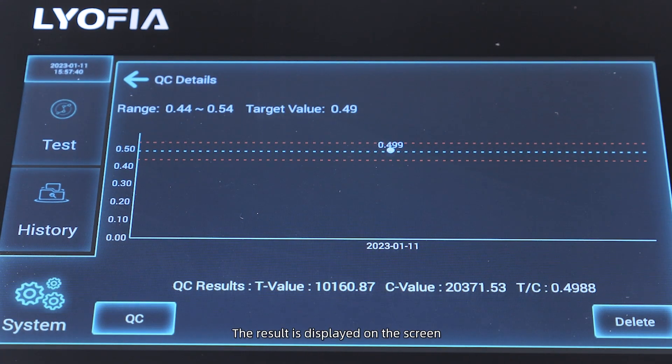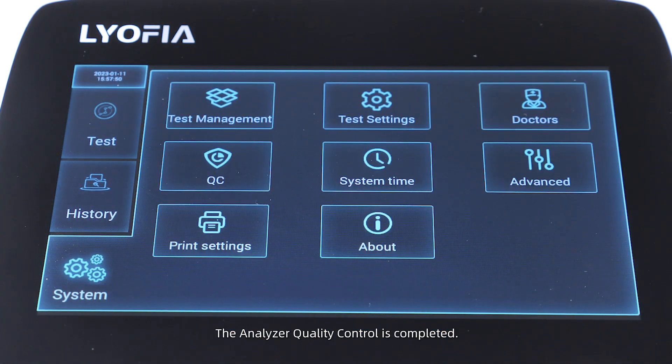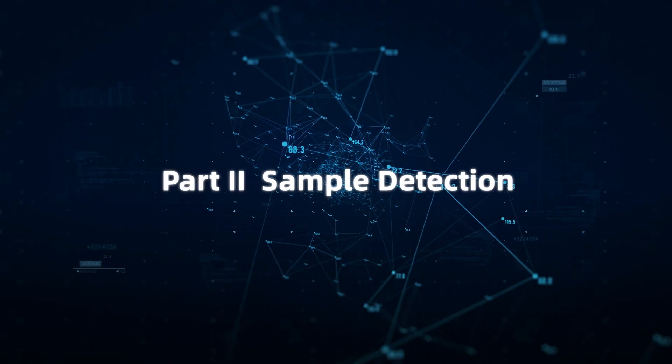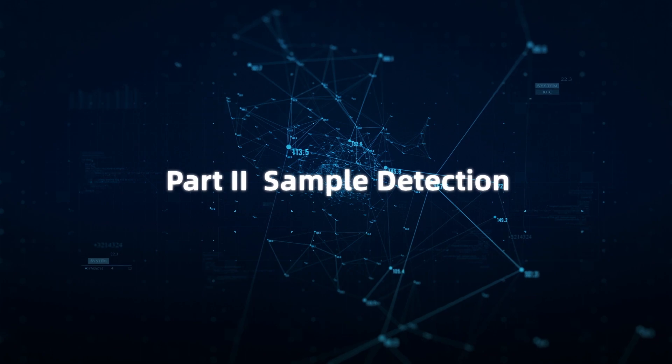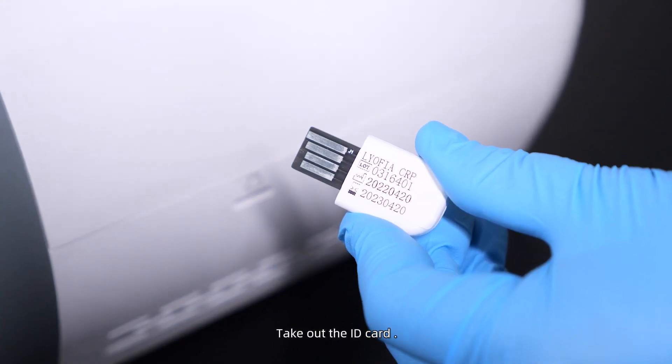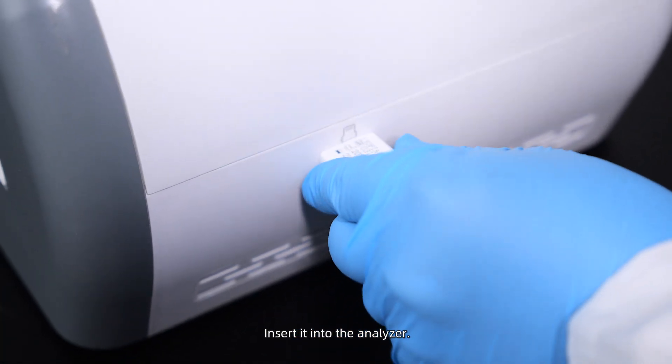The analyzer quality control is completed. Part Two: Sample Detection. Take out the ID card and insert it into the analyzer.